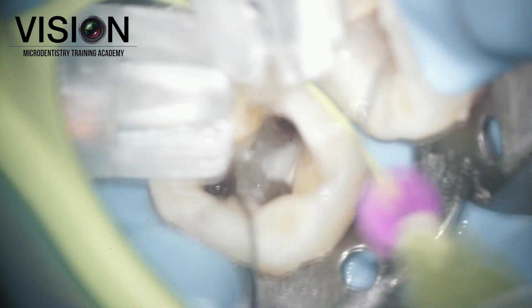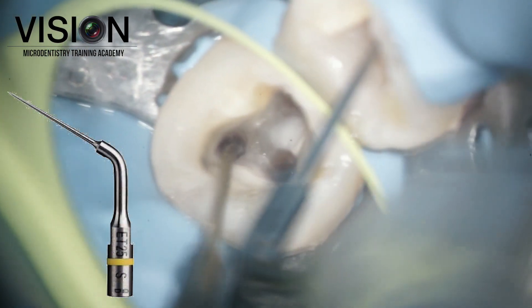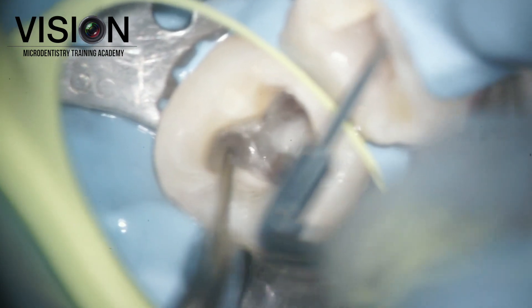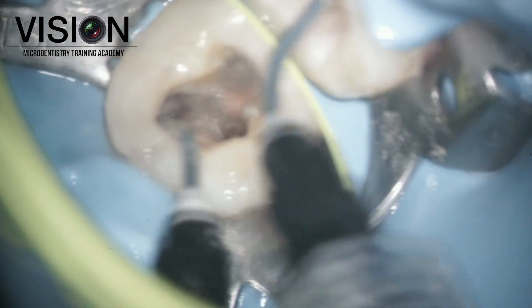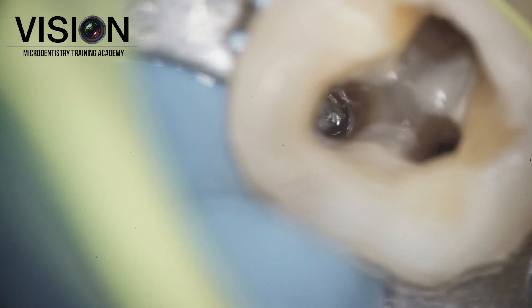We used liquid EDTA and irrigated the canal and activated again with ultrasonics to try and loosen out some debris. Once that was done, we decided to use a retrieval tool for retrieving the entire fragment in total.